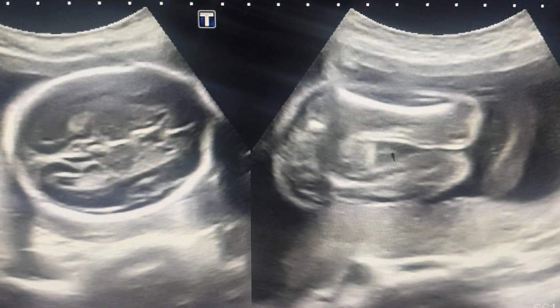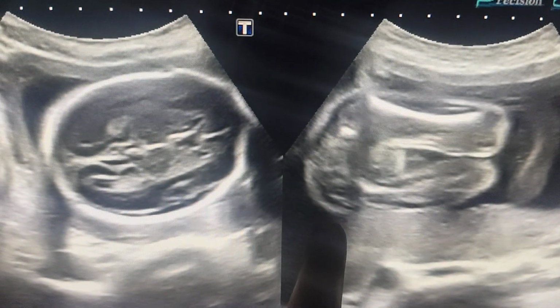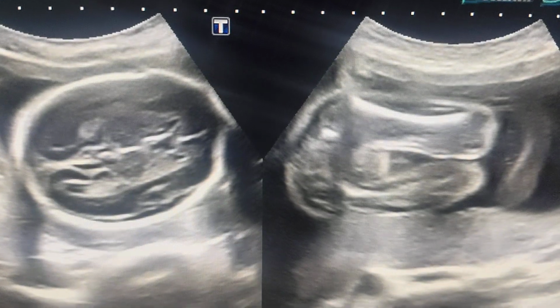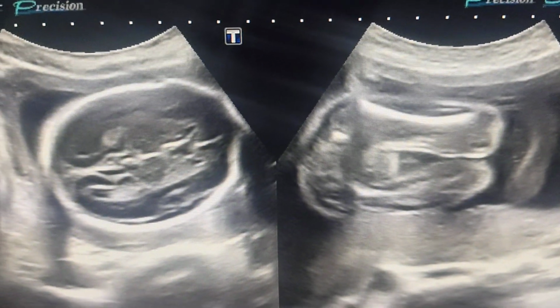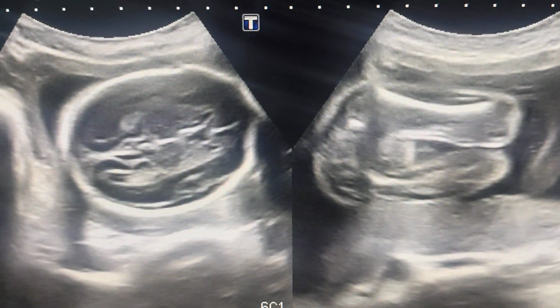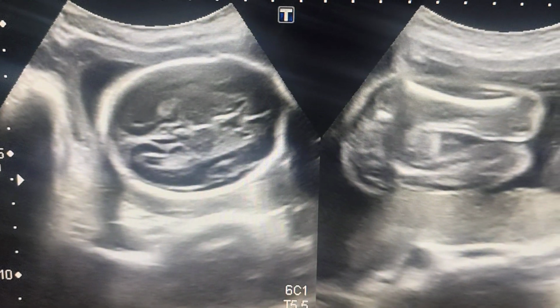In this image, when we talk about the placenta, it is posteriorly lying. Placenta can be anterior, that can be posterior, or covering the internal os, that is labeled as placenta previa. Third parameter used in fetal biometry after the second trimester is abdominal circumference.